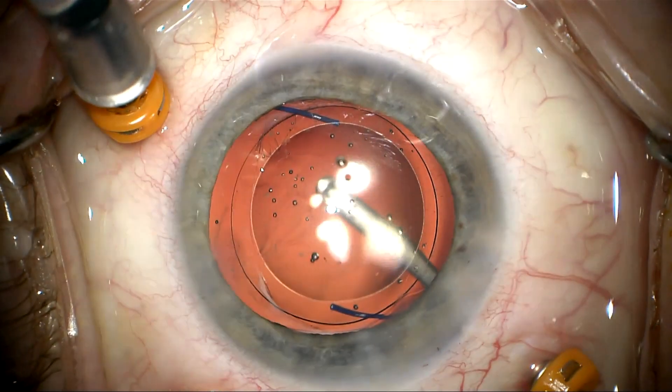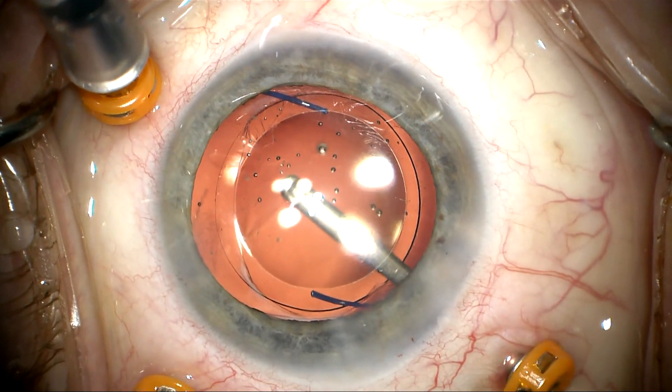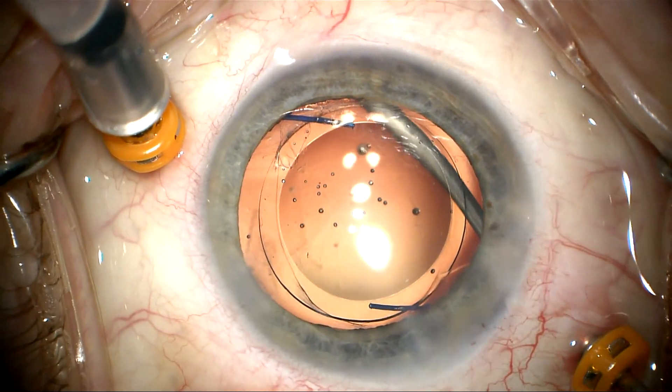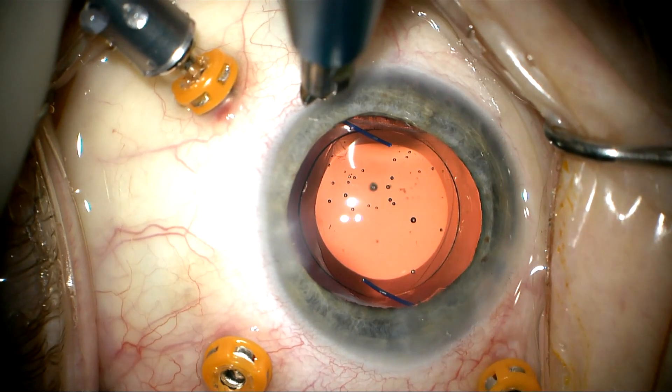The view is very good. You can see the trocar insertion here, and you can also see the edge of the optic clearly, because I'm focused more anteriorly. The vitreous is completely cleared out. Now I'm going to do a capsulectomy — remove the posterior capsule and clean up that redundant capsule that was flopping over the edge of the optic so it doesn't cause any visual problems.